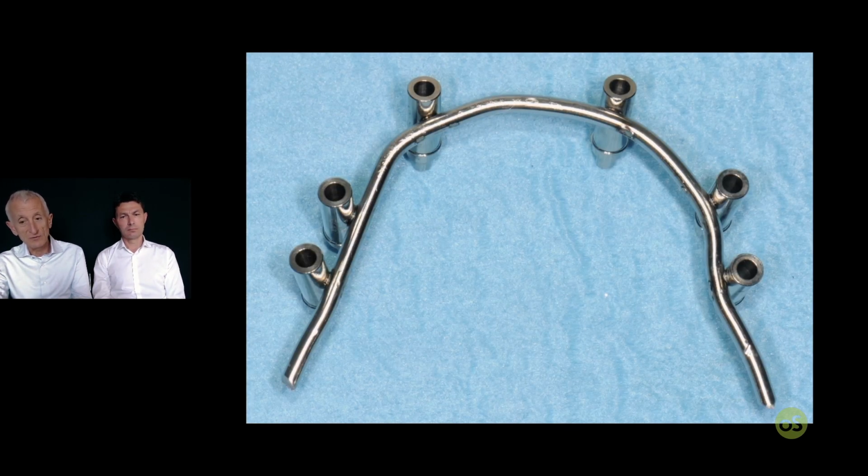Now, remove the framework and hand it to your lab technician, who I suggest is chairside with you. A lab technician loves to stay in their labs, but sometimes we need to extract them and summon them in the office, because I think it's much easier and the final result is better.